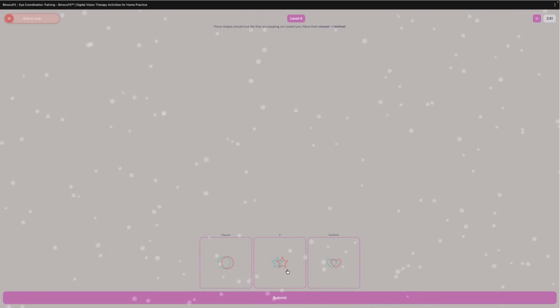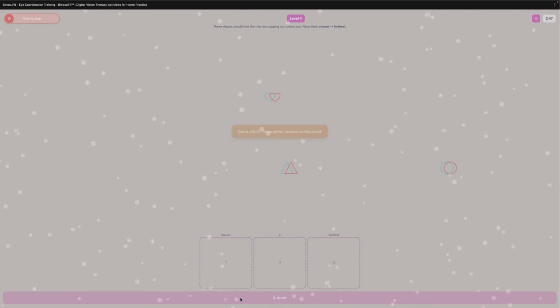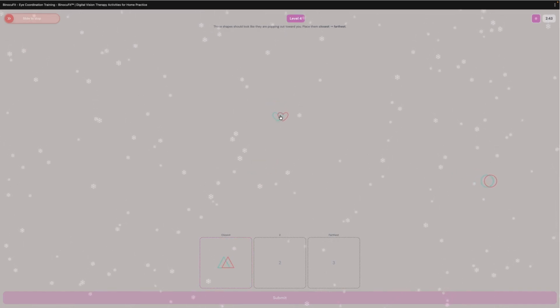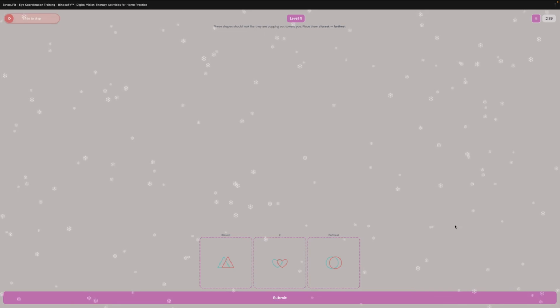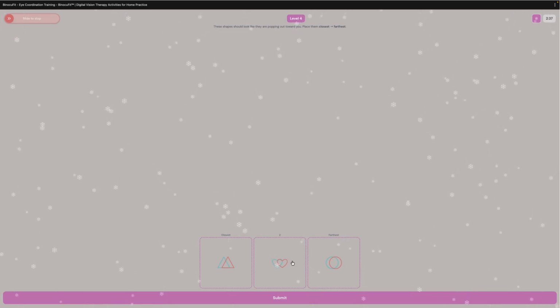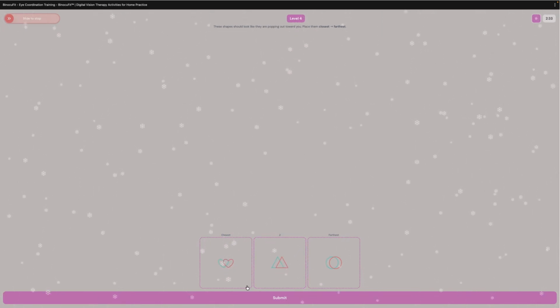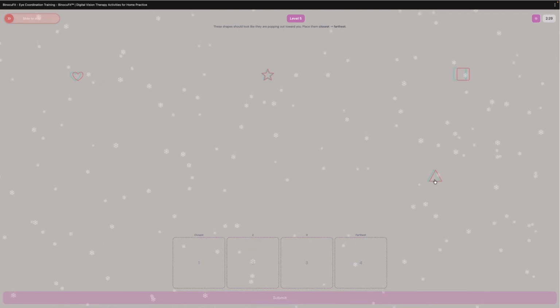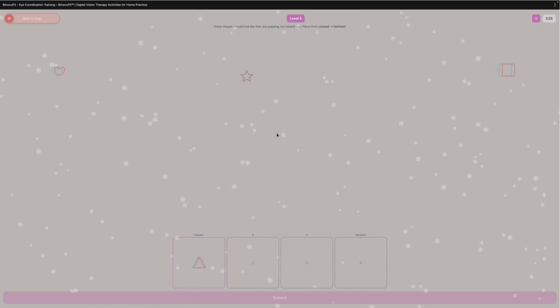So we have to remember that whenever we're using disparity and anaglyph glasses, there are cues. So a patient could try to trick the system and just kind of get them right. But if we keep the glasses on, the cancellation is really great. And, as long as they have the glasses on and they're making the decisions, then they should really be seeing the depth. But we are looking to have self-motivated patients, obviously. They can kind of self-monitor whether they're actually seeing what they need to see or not.